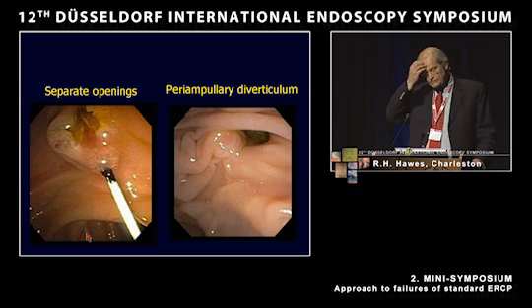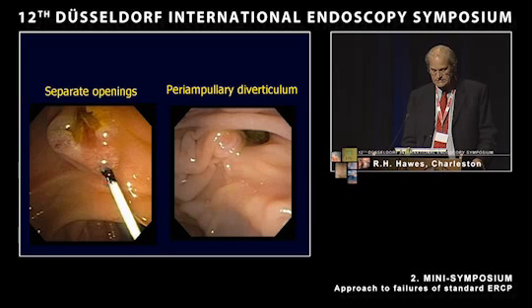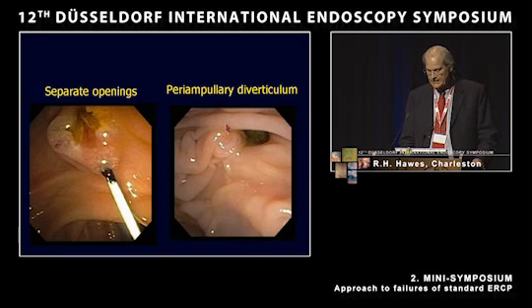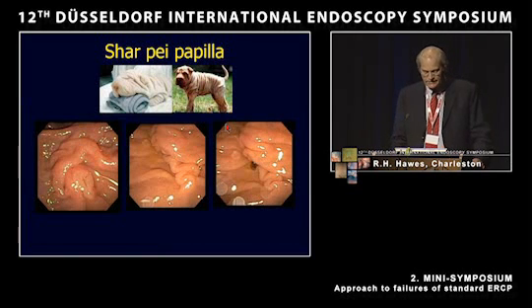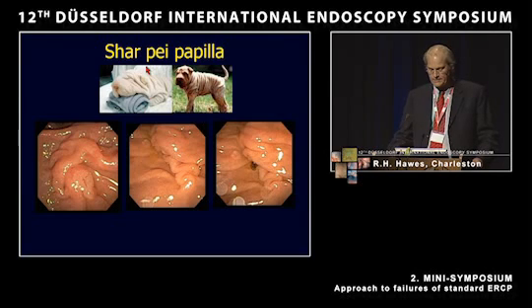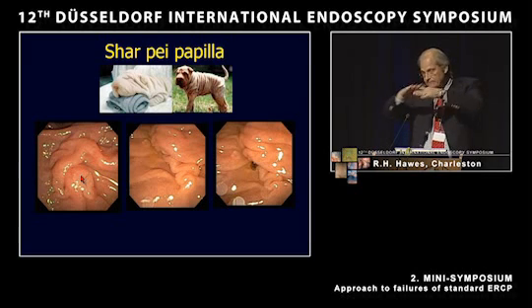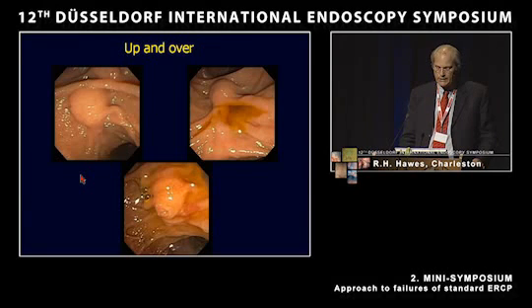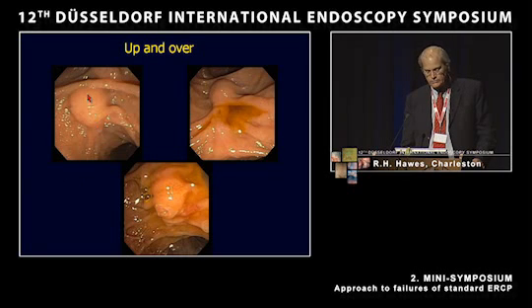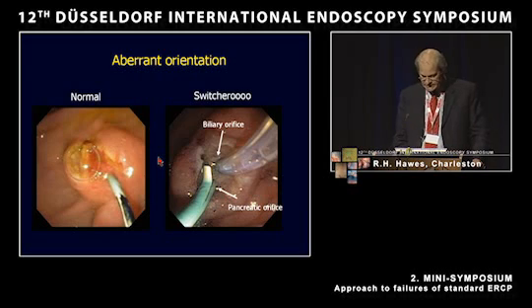Here are some case examples. This case shows a separate orifice — you can see the pancreatic stent in the pancreatic orifice, obvious ampullary tissue, a sphincterotomy here, and the bile duct was up here separately. All of you have seen examples of periampullary diverticula. This is the Shar pei papilla — named after the Shar pei dog — with multiple folds you have to navigate around. This is an example of the up-and-over: you go up, then down, then up again. And here is an example of the aberrant relationship between the biliary and pancreatic orifice.